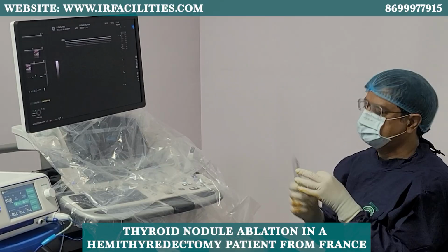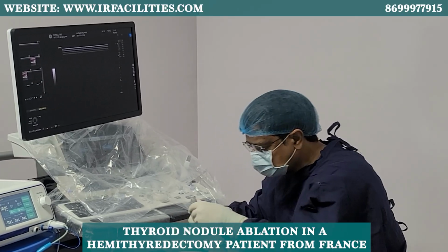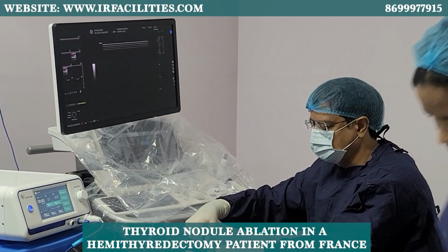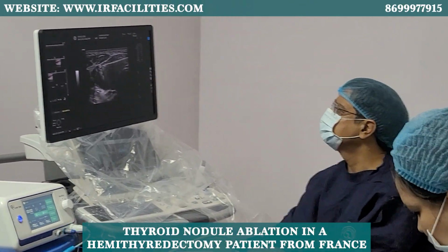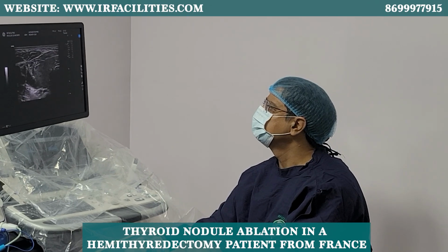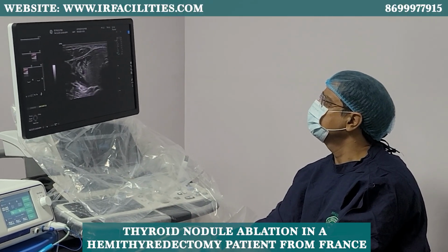So fluid will have local anesthesia in it all around thyroid, so she will not have pain also then. I'm making some collar in front of thyroid also.